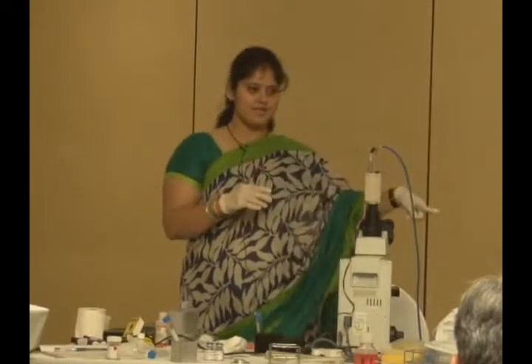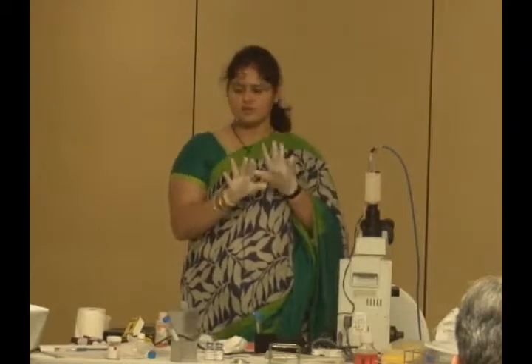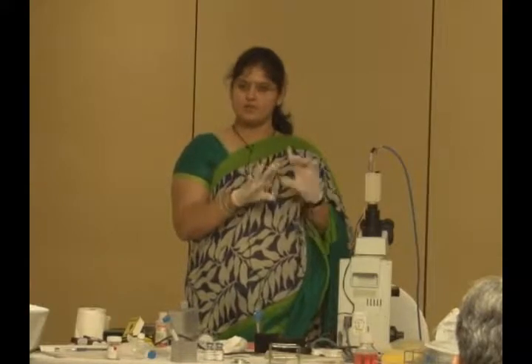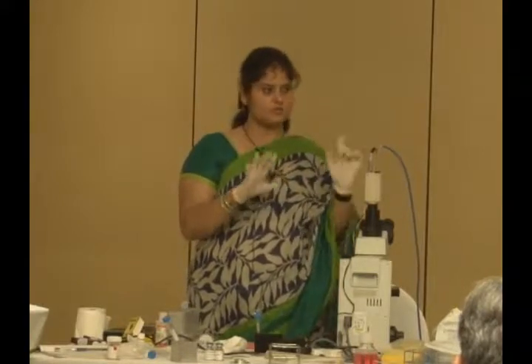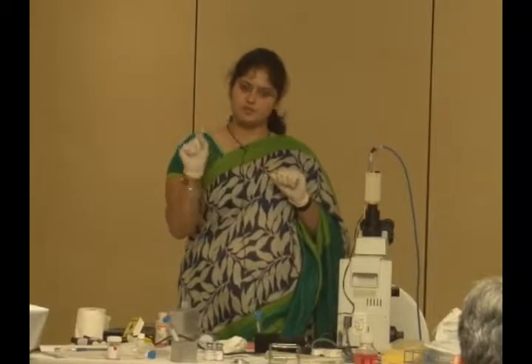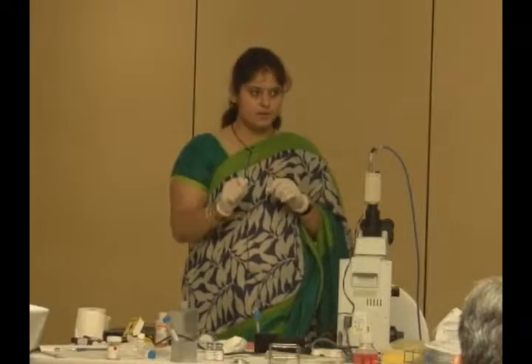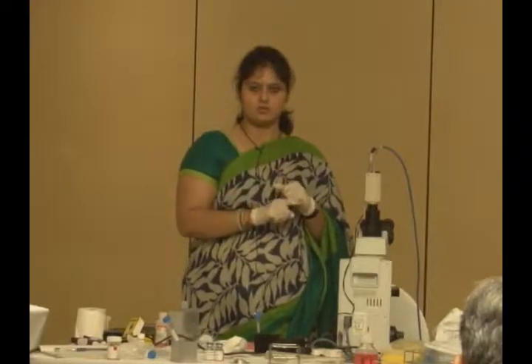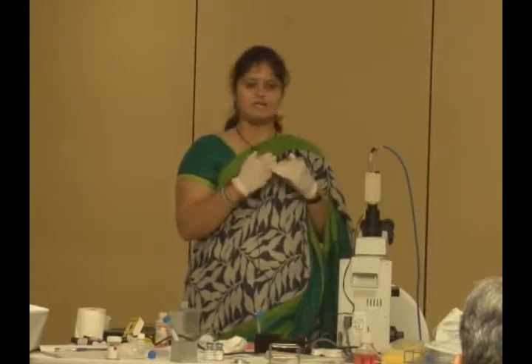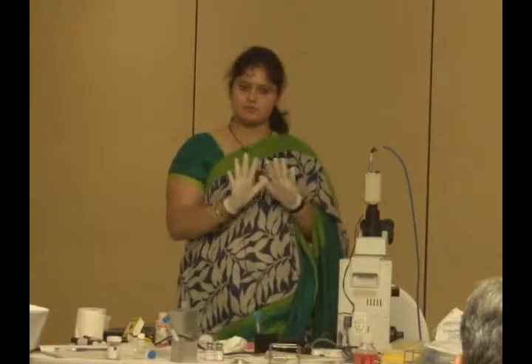Now after 10 minutes, we remove the supernatant. Now there is no need to change the tube. Add sperm wash media again, 4 ml. Give it a second wash with 10 minutes, same RPM. After that, we remove supernatant, add 0.5 ml of the medium, mix it well. We will check the count and the motility post wash, and then you can examine the sample. Same step we have to repeat.